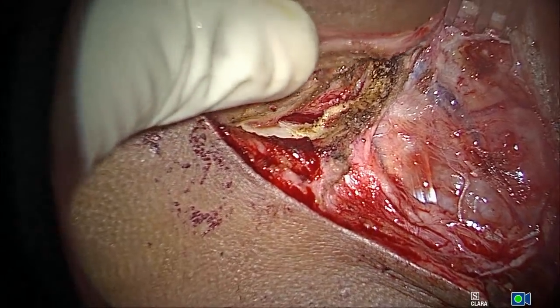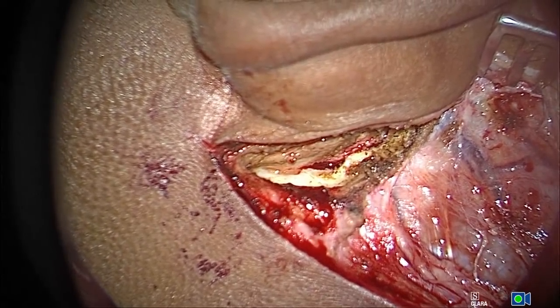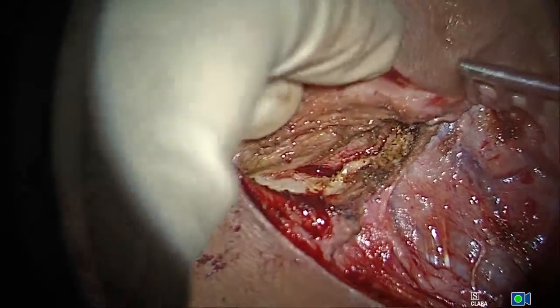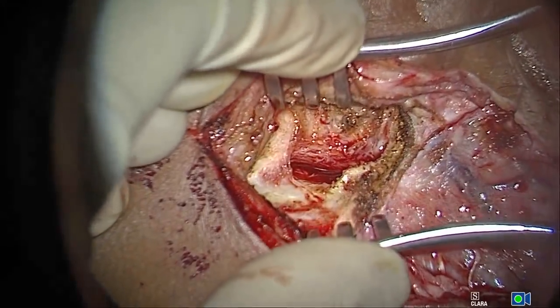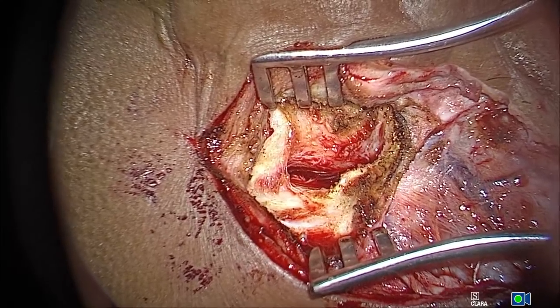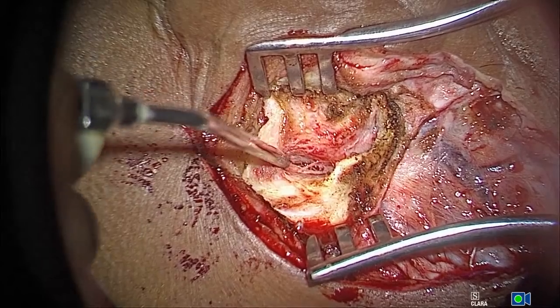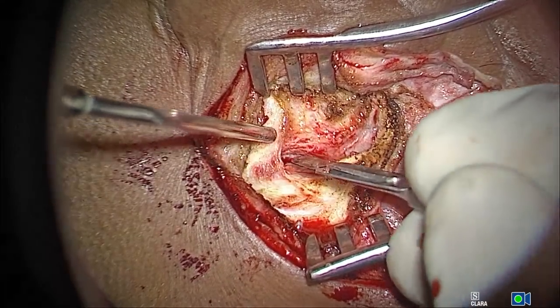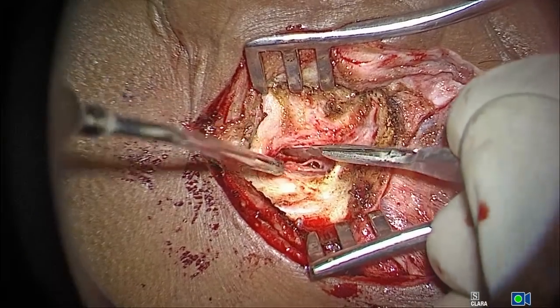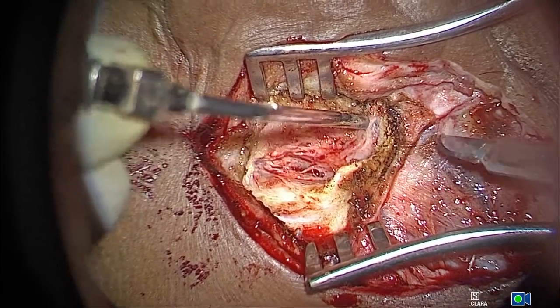Now can you give me a retractor? Another important thing which I want to tell you. Retractor please. I hope it's in focus now. Yes. So now you can see that that's the flap. To me, it's very important that I have a very good two-handed technique. I think any surgery is all about dexterity. How dexterous you are, which makes a good surgeon, of course, with the concept.